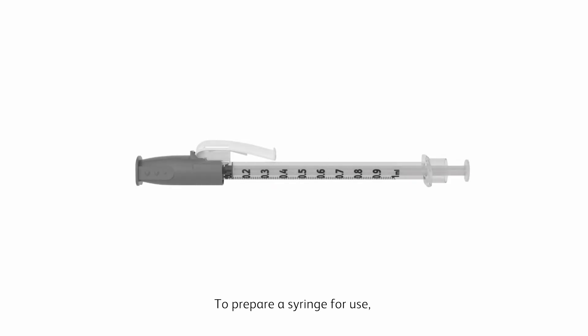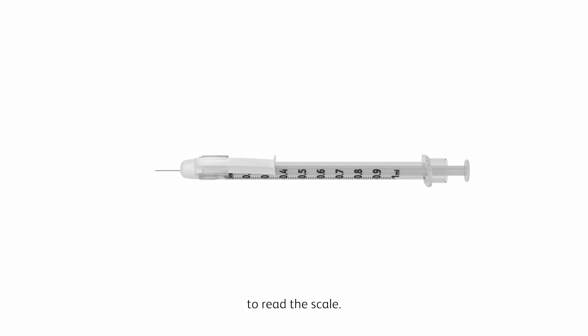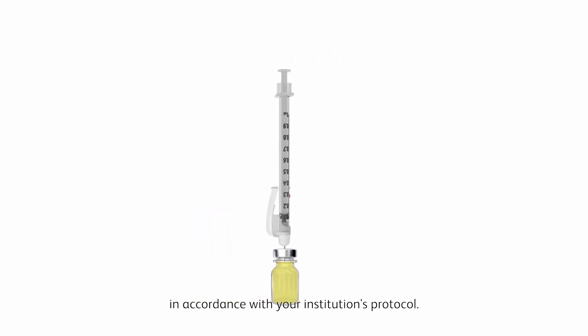To prepare a syringe for use, pull the shield straight off the needle. Rotate the safety arm as needed to read the scale. Draw up the medication to be administered in accordance with your institution's protocol.